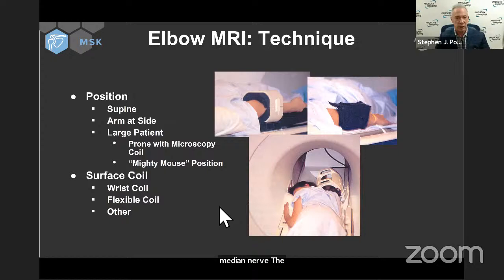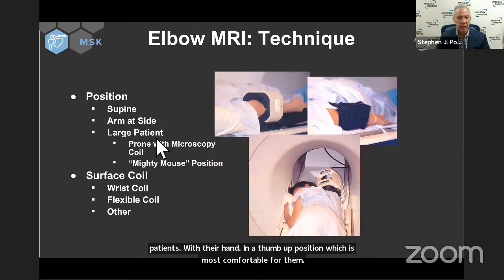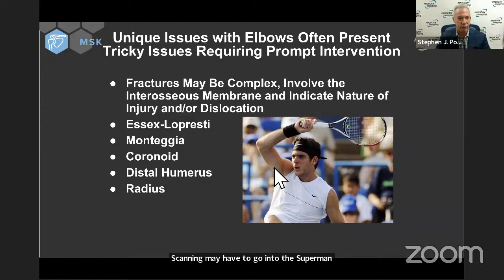Now, I'd like to start out a little bit with technique. The patient can lie with the arm at the side in a much more comfortable position using either a rigid or flexible coil. I like to have my patients with their hand in a thumb up position, which is most comfortable for them, somewhere between pronation and supination. Some patients, when you have to have very high resolution imaging with microscopy coil scanning, may have to go into the Superman position, arm over the head. But this is only sustainable for about 30 minutes.